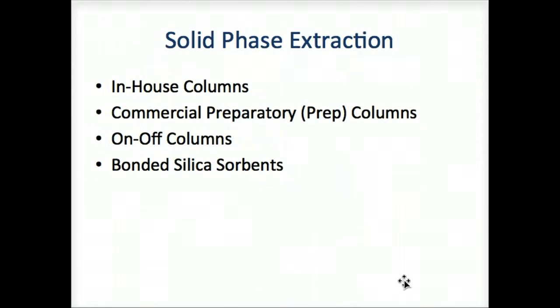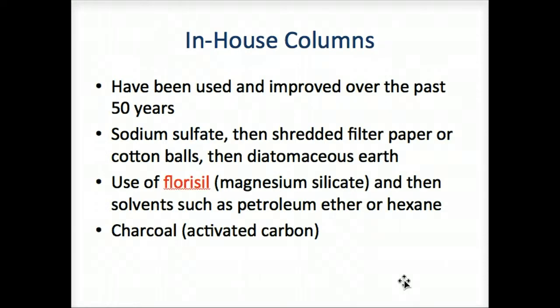Solid phase extraction is next on our list. This is an outline of the topics we're going to touch on here. Solid phase extraction was developed due to the drawbacks of liquid-liquid extraction techniques. These methods allow for the isolation and purification of fractions containing drugs and their metabolites.